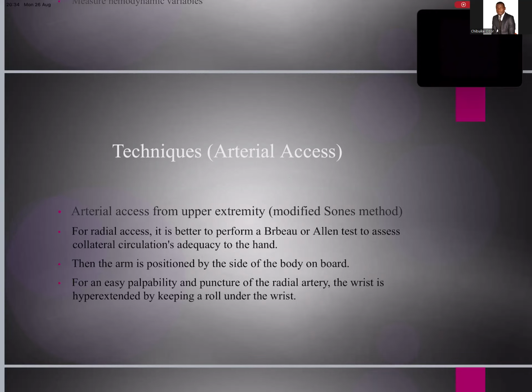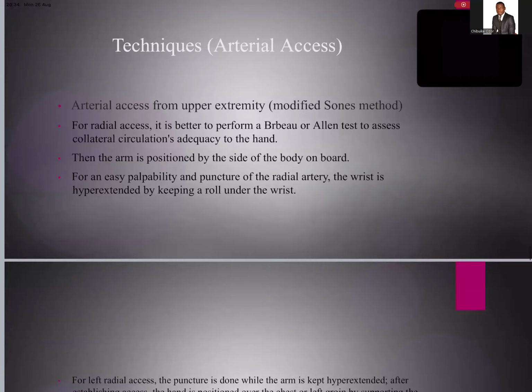And also, before the radial access, the patient is usually pre-medicated with either midazolam, fentanyl, or nalbuphine. This is actually to avoid radial spasm that may be provoked by just anxiety.